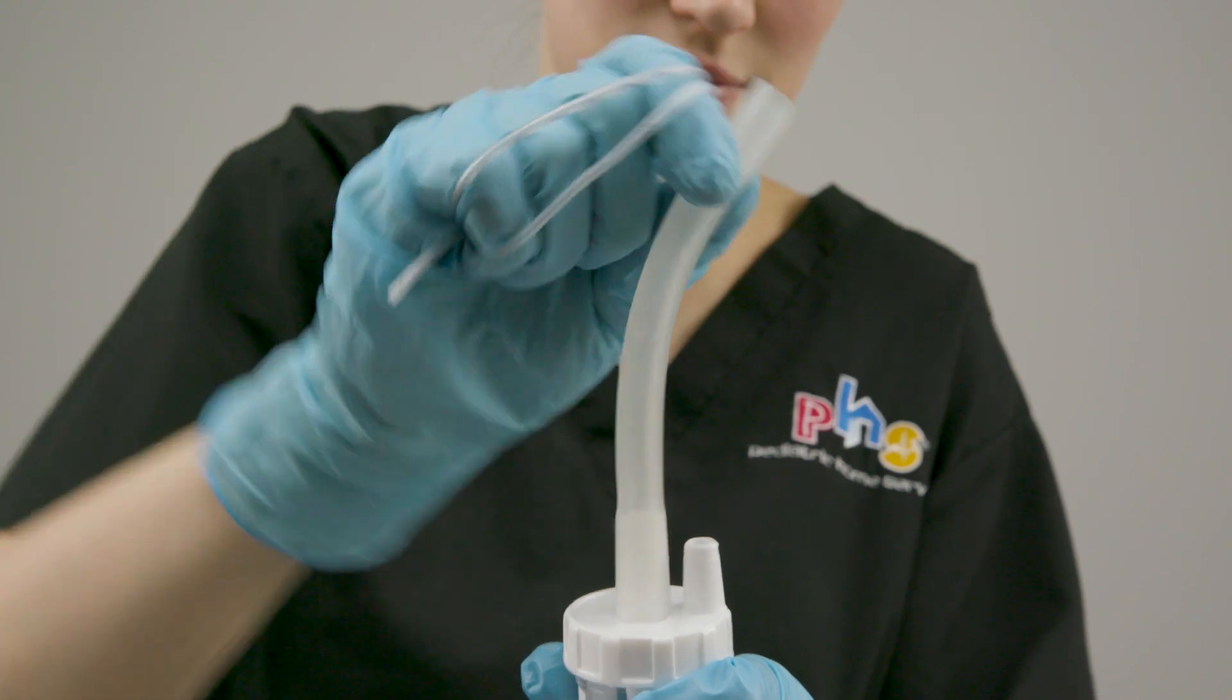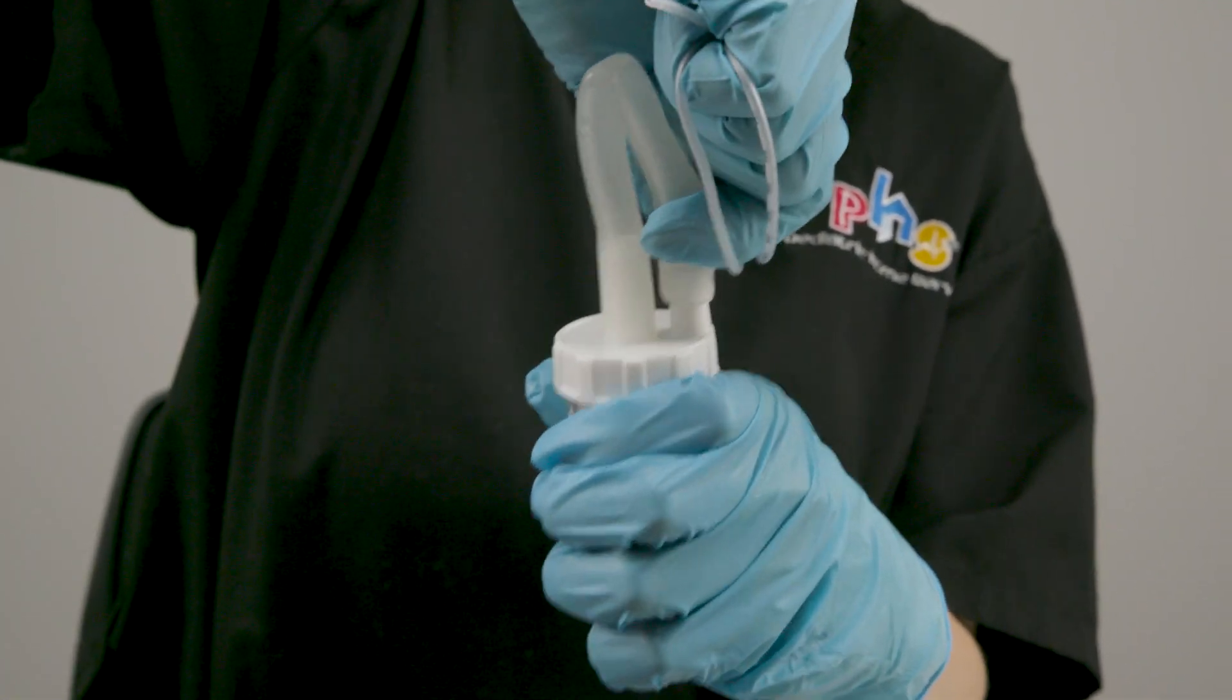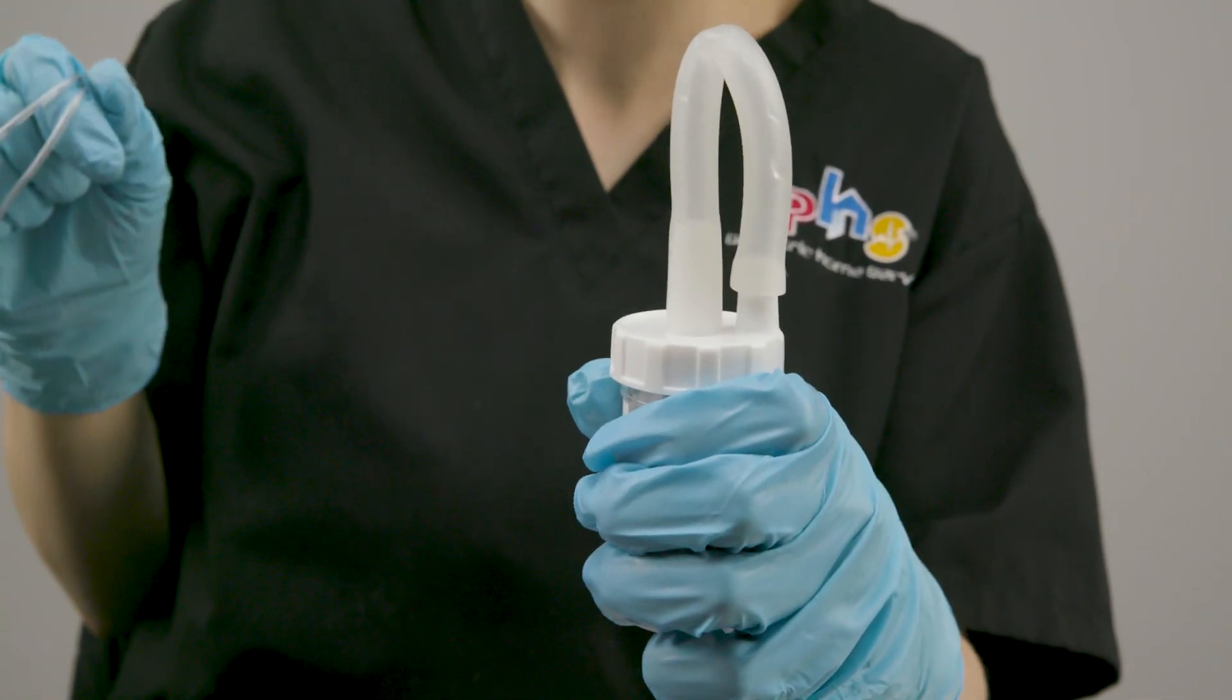To seal the specimen trap, fold the flexible section of tubing across to the other side of the trap and firmly push it onto the tubing port.